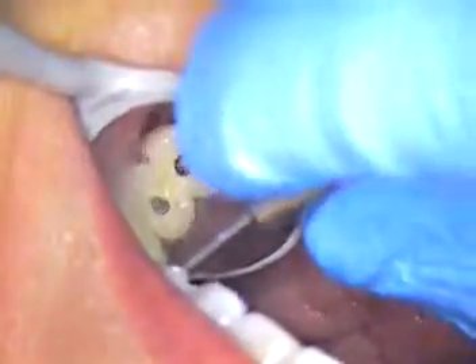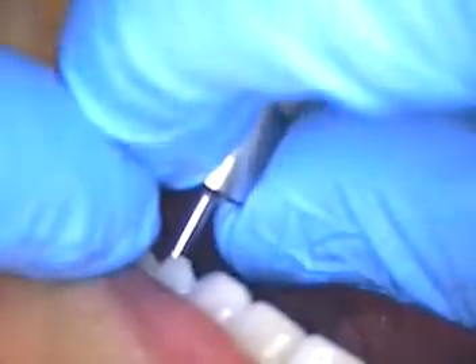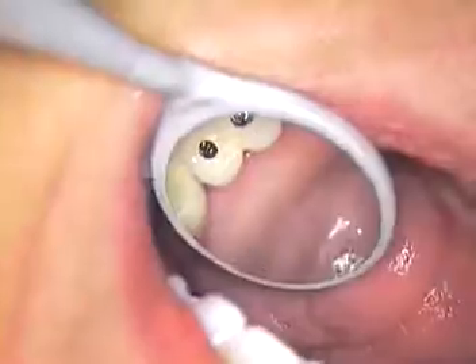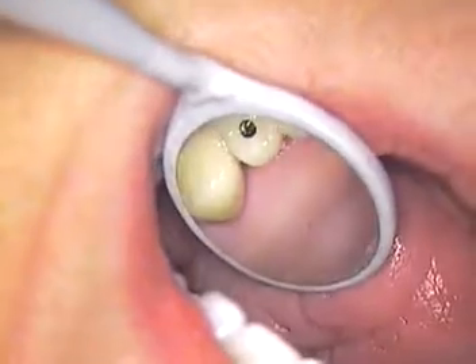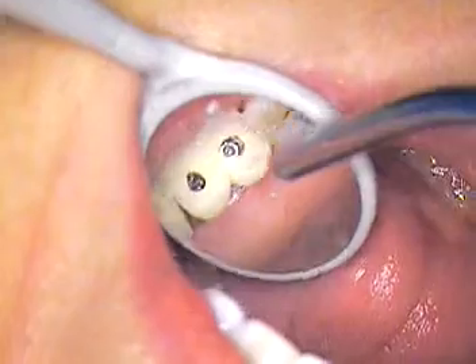So here we are with the access hole. We've got a straight line access for the anterior abutment — and success, ladies and gentlemen. Our patient's going to go home with a nice pair of crowns. She did not have to go through surgery again. The dreaded treffining of implants — no one should go through that. It's just a good message that says we can take care of this without having to go through a long, drawn-out procedure.